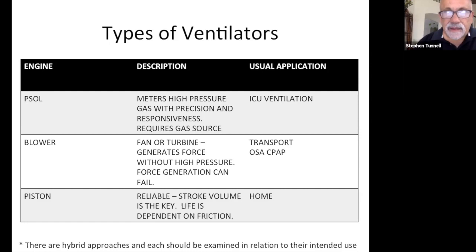Many paralyzed patients who cannot breathe or need support breathing are on piston-based ventilators. That's what you typically see under the wheelchair. There was one piston-based ventilator that was famous in the ICU. It was this giant device out of University of Winnipeg.